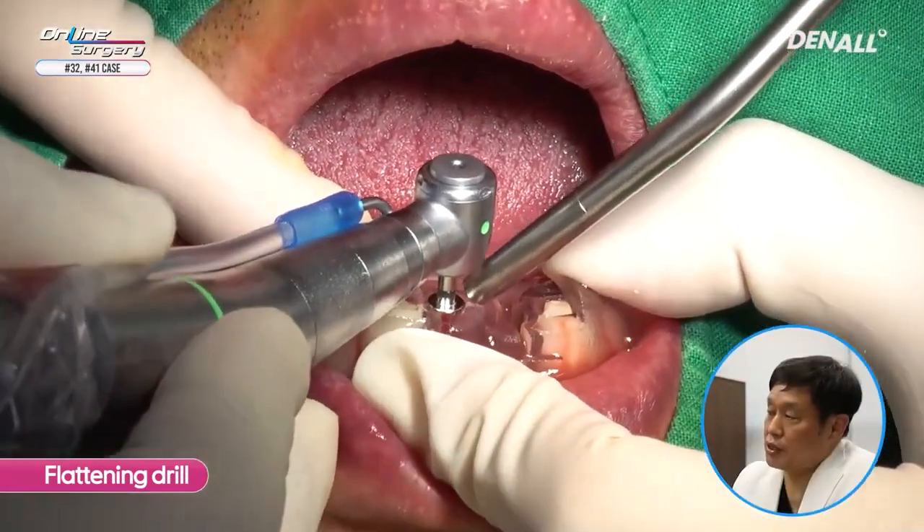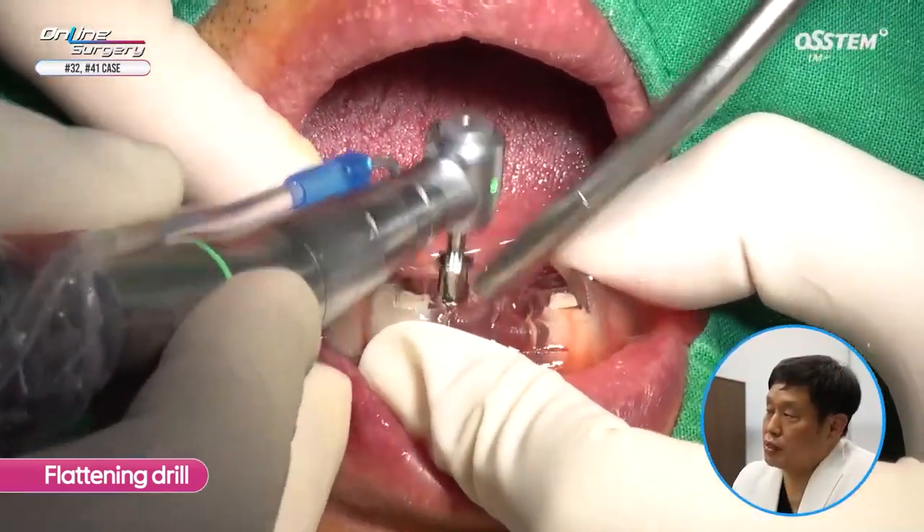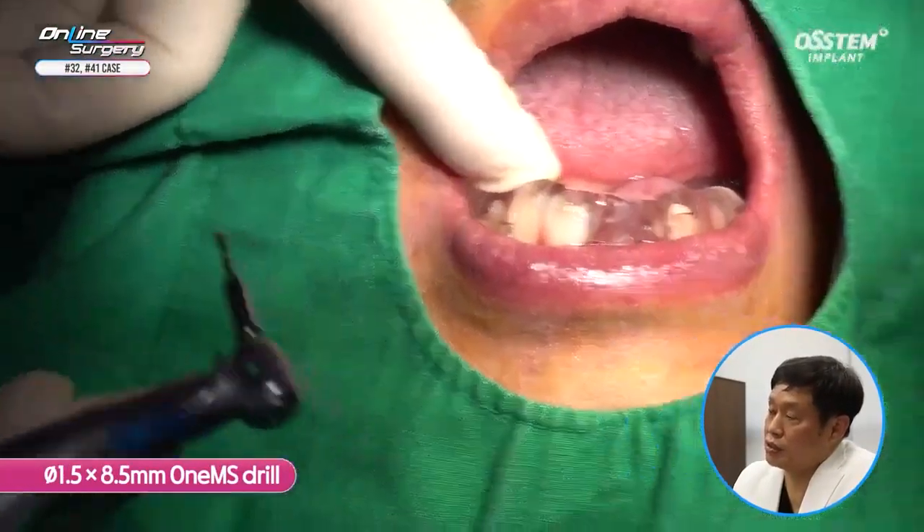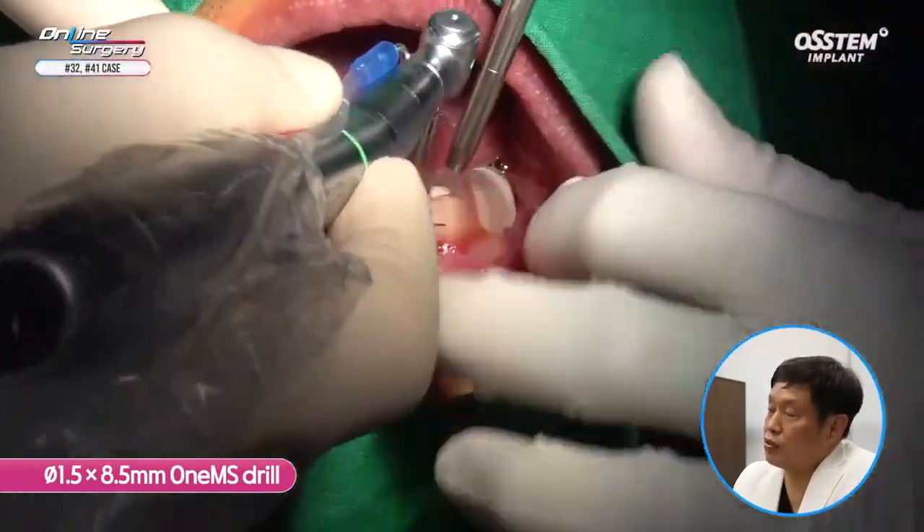Because it is the lower anterior area, using a flattening drill is recommended. In the case of the lower anterior, the drill can slip so we need to pay a lot of attention. Fixate the template with your hands.